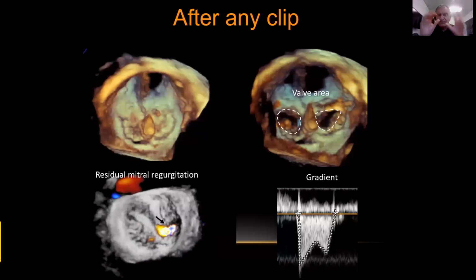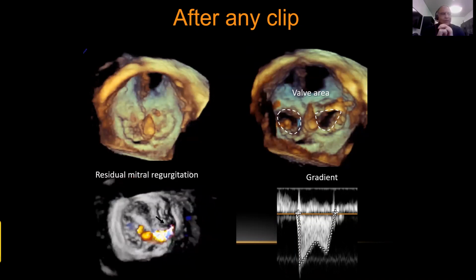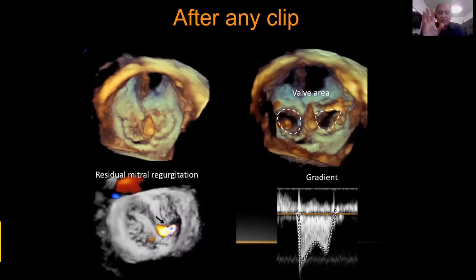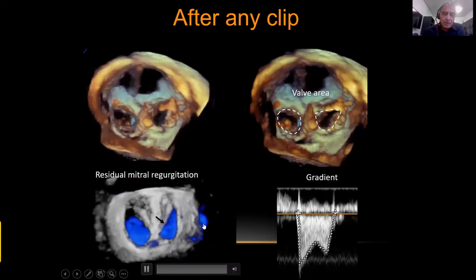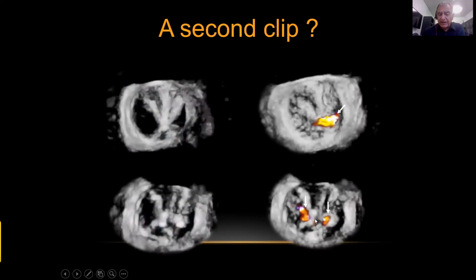This was a very intelligent point from the manufacturer, because otherwise, if I put one clip and then another clip, I would have to spend another 10,000 francs for the second clip, which would be unfortunate. But in this case, up to the fourth clip, the cost of the clip is the same. So what do we do with these cases here? Well, with these cases we decided to put a second clip, with pretty good results.